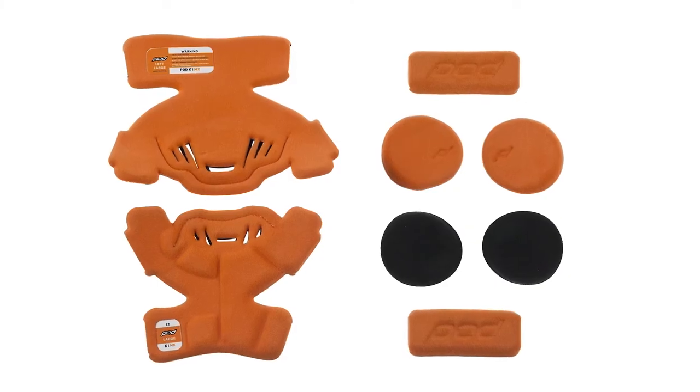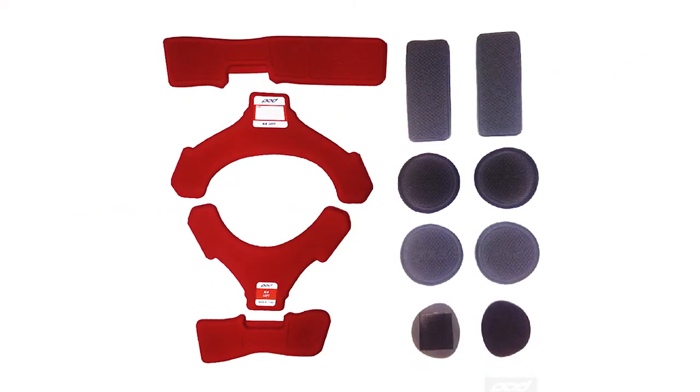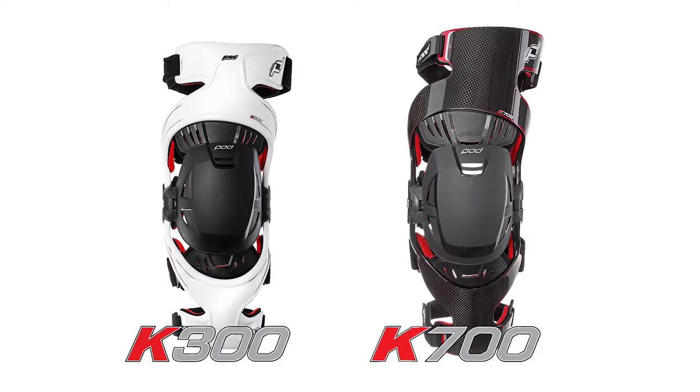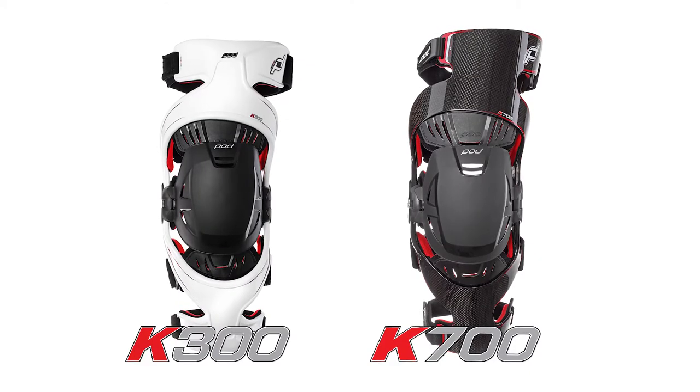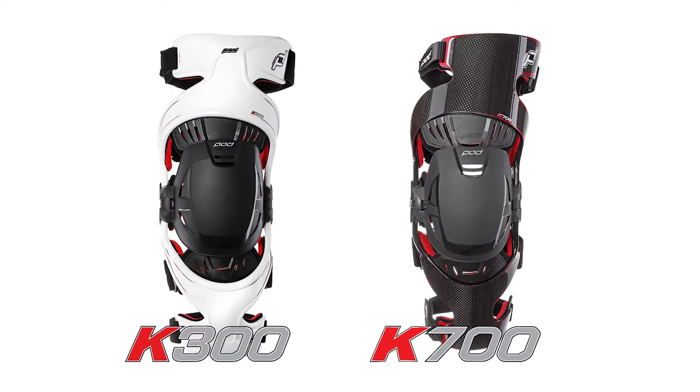It's color-coded, so if you're replacing the K1 padding, it's orange. If you're replacing the K4 padding, it's red, and the K8 is going to be blue. If you have a K300 or a K700 brace, you can get padding kits for that — they will attach in a similar manner.